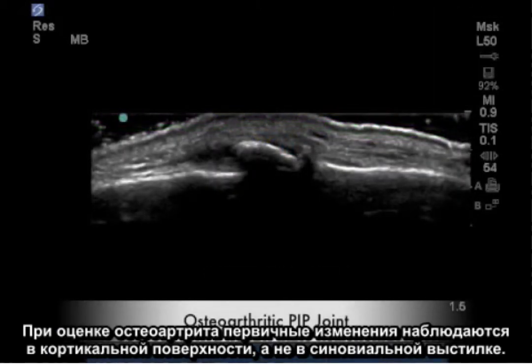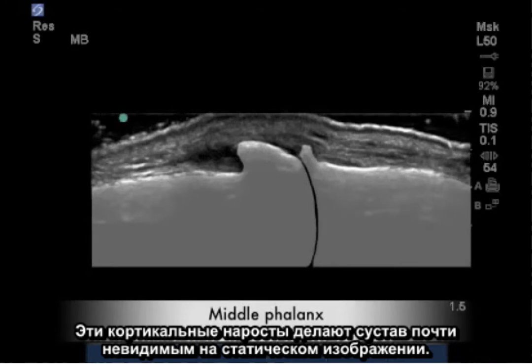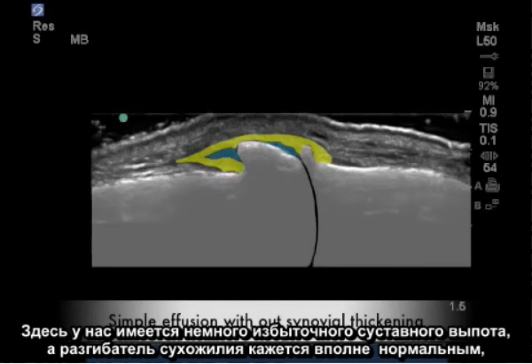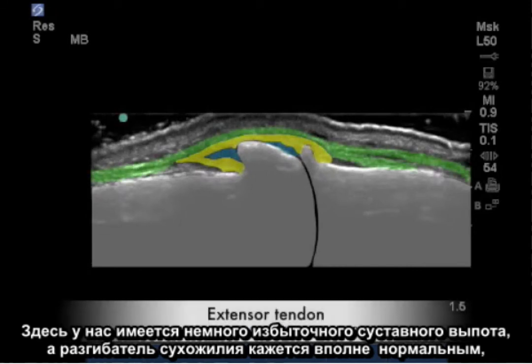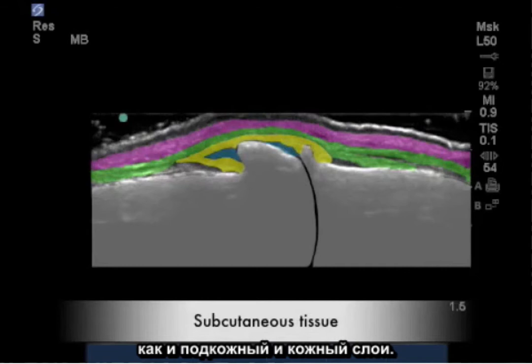When evaluating osteoarthritis, the primary changes are observed in the cortical surface rather than the synovial lining. These cortical growths make the joint almost impossible to see on a static image. In yellow is the synovial lining, which appears normal in thickness. Here we have a little excess joint effusion. The extensor tendon appears fairly normal, as do the subcutaneous and cutaneous layers.